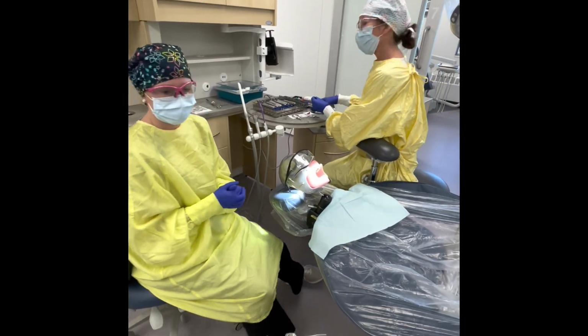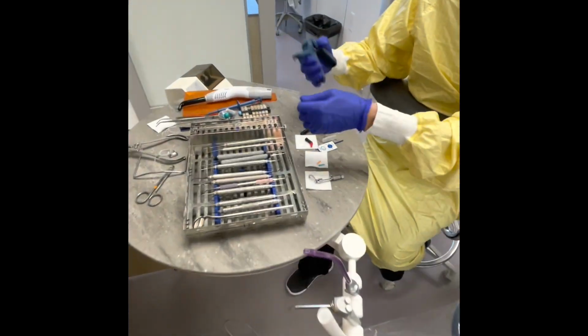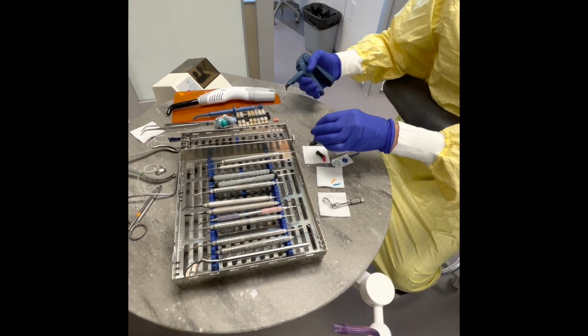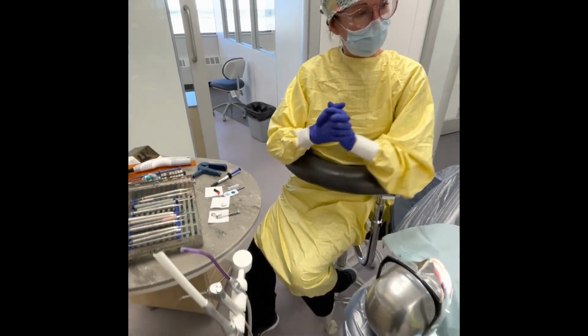I'm just going to test this composite cartridge now. So I'll just place it in my little composite carrier, take the lid off. I'm just going to disperse a little bit on some gauze to make sure that it's working and it's good. And we're good. I'll set this down here for later when we go to fill that filling.